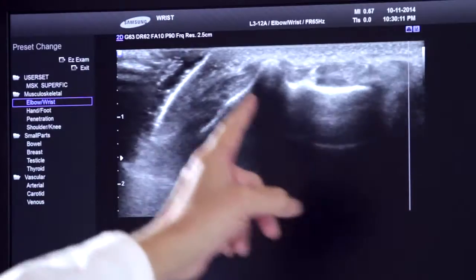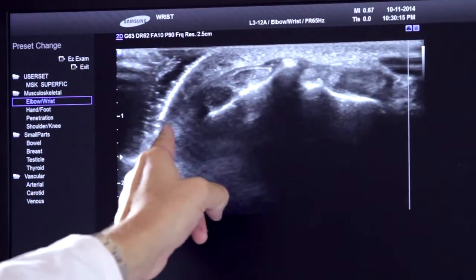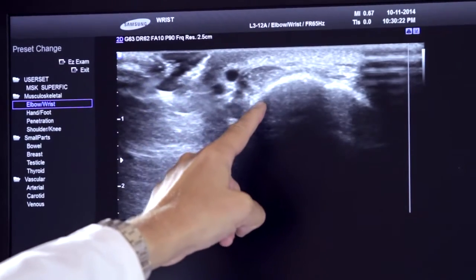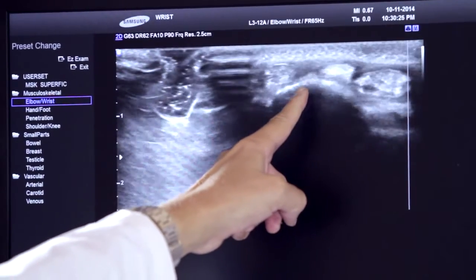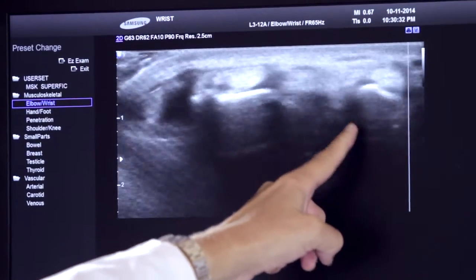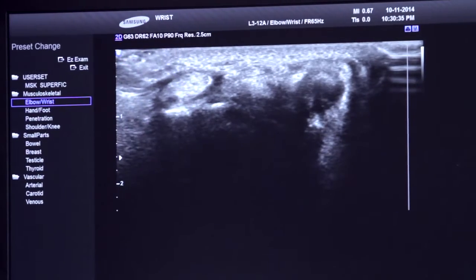So, if we start from the second extensor compartment and we count on the radial side, we reach the first compartment of the extensor tendon, which obviously contains two components. We can see the first compartment, the second, Lister's tubercle, the third compartment, fourth, fifth compartment, and finally the sixth, the last compartment, where, as you know, runs the extensor carpi ulnaris tendon.